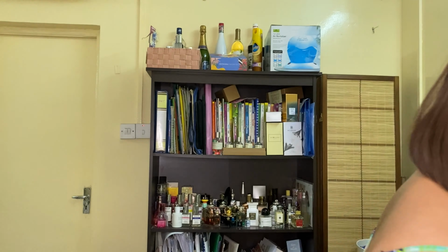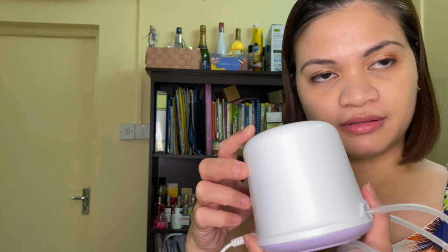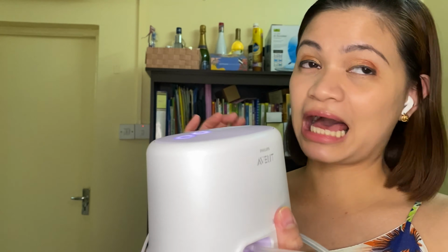There's no average, but the average ones are 21, 19, 27, 24, like that. I think this one is 24. That's why sometimes it's a little painful for me, this one. And with regards to the motor, it's not that loud, and it has a good light also, and I don't know if it's LED or what.